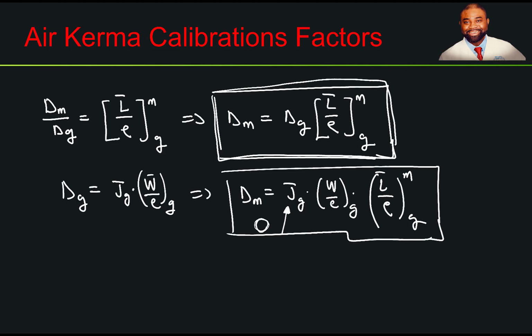But in order to determine accurately the dose deposited within the sensitive volume, we need to measure the exposure within that sensitive volume. For that we need the air-kerma calibration factor as well as the exposure calibration factor, N_X.